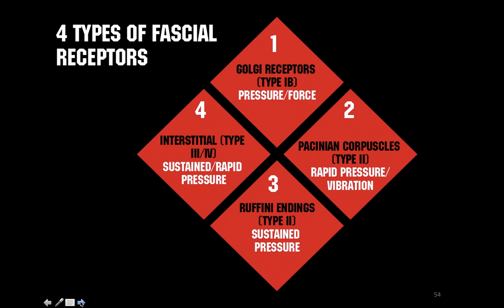So we would actually take our tool and show you a technique to increase awareness around there. And then after we've increased that awareness, we may do a post-test. Maybe that's a toe touch, maybe that's a squat, maybe that's some rotation, whatever the case may be. And then we'd apply some Rock Tape on there to hold on to those newfound changes. So the idea of firing up the body with certain stroke rates is possible. And then conversely, we have Ruffini nerve endings, which may be responsible for relaxation of the tissue.